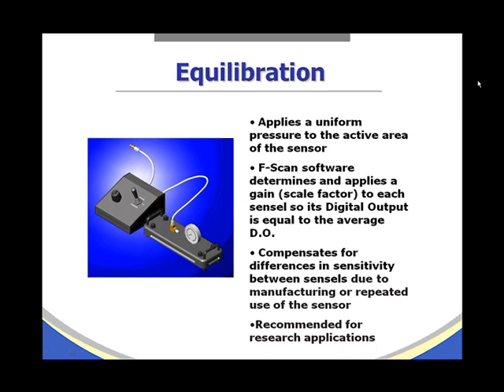Something else to consider, especially for research applications, is equilibration. Equilibration applies a uniform pressure to the active area of the sensor. The F-scan software determines and applies a gain or scale factor to each sensor so its digital output equals the average digital output. Equilibration compensates for differences in sensitivity between sensor cells due to manufacturing or repeated use, and is recommended for research applications.